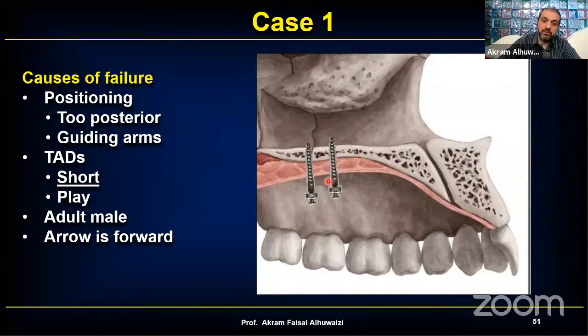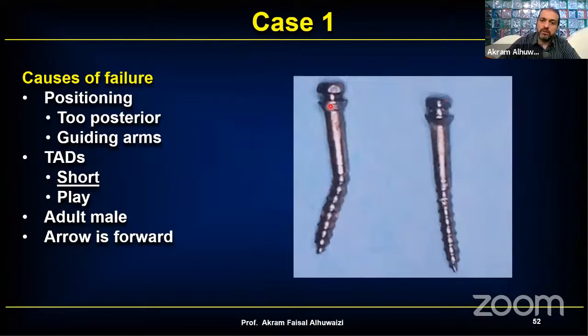of the TADs. Without this bicortical perforation, you're going to put so much strain on the TAD, and the TAD can bend, or it can just travel through the cortical bone, and cancellous bone, sorry. And that's why these will fail. You have to have bicortical perforation. And this is what I got. This one was bent, and it's a stainless steel 2.0 screw, but still was bent under the huge amount of force that these appliances generate.